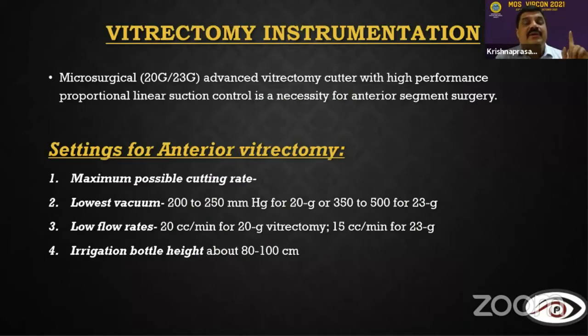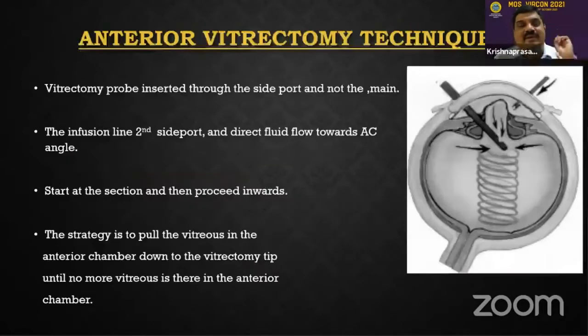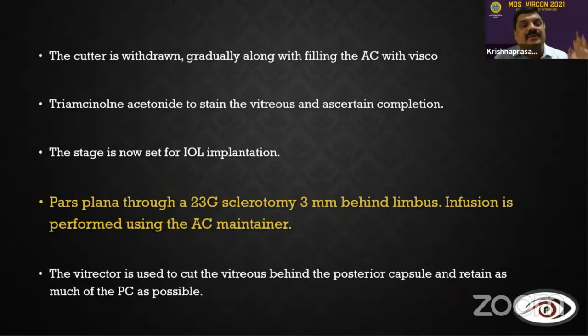So settings for anterior vitrectomy, very important: maximal possible cut rate, lowest vacuum, lowest flow rate, irrigation bottle height has to be around 80 to 100 centimeter. This is about the few settings for anterior vitrectomy technique. Always with the infusion line, I do a vitrectomy through the side port. Always pull the vitreous in the anterior chamber down to the vitrector tip until there is no more vitreous in the anterior chamber. You can put triamcinolone down, make sure that there is no vitreous in the AC.